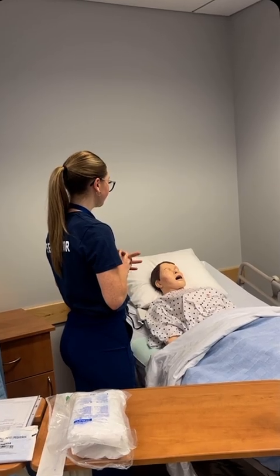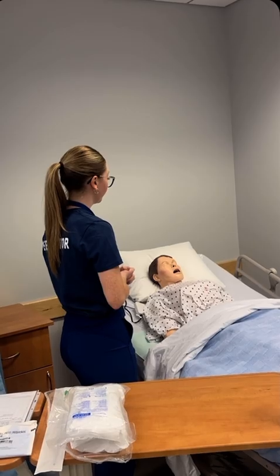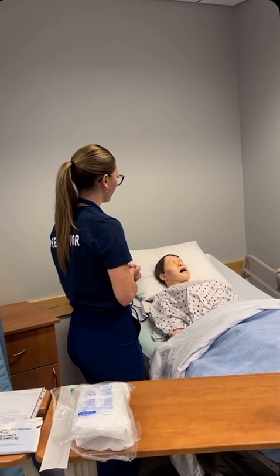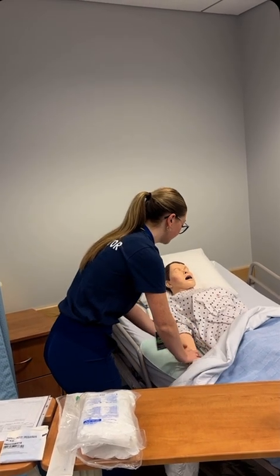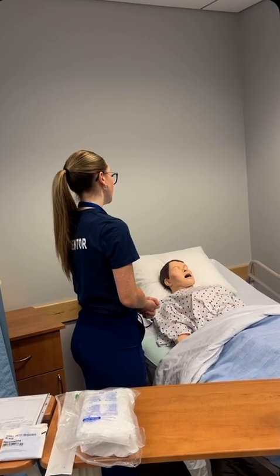Identifies the patient with two identifiers and confirms with the armband and asks how they would like to be addressed as well as their pronouns. So I'm just going to confirm your first and last name along with your date of birth and check it with your armband. And what are your preferred pronouns and how would you like to be addressed?